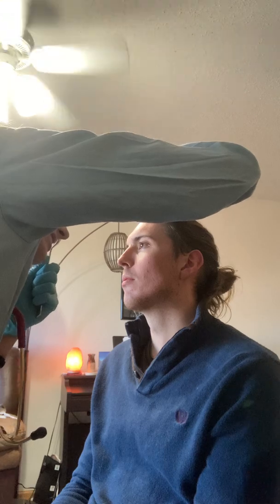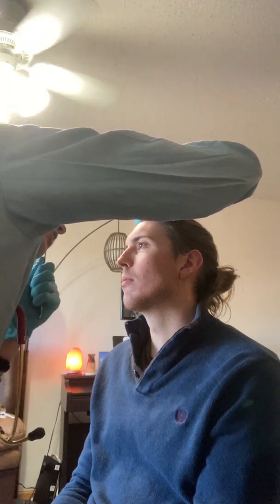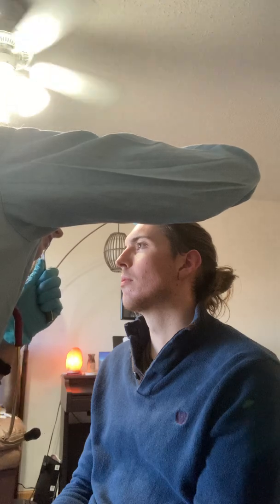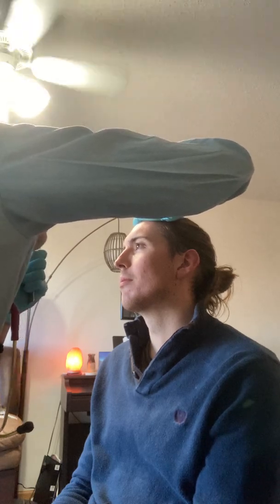And I am going to stand at a 15-degree angle and come down and in, looking at the optic fundus, noting its color, and it's pink and yellow in color. It is oval in shape, has good margins. Noting your fovea and macula. Looks great.